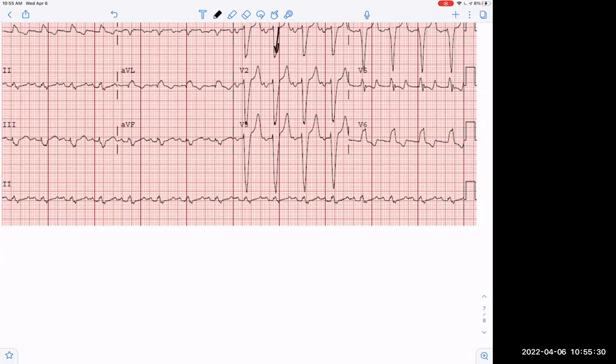You're going to have to see it anytime you're in your rotations, anytime you get out on an ambulance at your job or what have you, and you have an opportunity to run a 12 lead on your patient. Run a 12 lead and interpret that 12 lead. If you're in the hospital and you have some extra time, look at the patient's chart, look for their 12 lead. I will tell you, the hospital is a great place to do it because you can actually get serial 12 leads. If you have a patient that's a STEMI or something they're concerned with cardiac wise, you can go into their chart by date and take a look at actual serial 12 leads. And perhaps you can pick up the progression of a disease process.